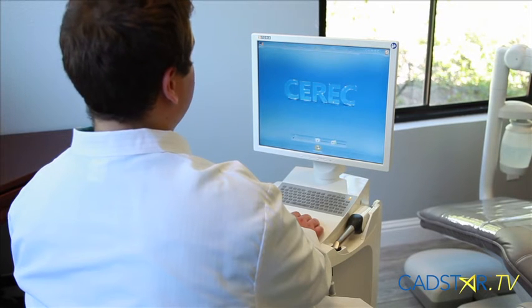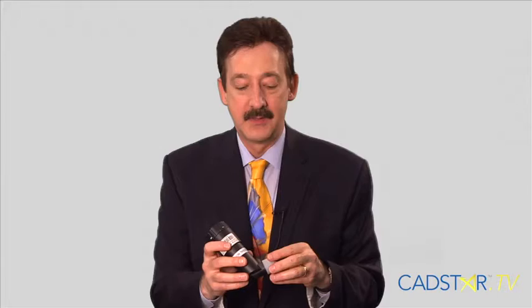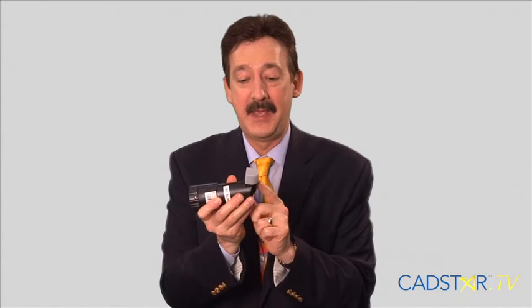Prior to starting your calibration process, there are a few things we need to remember — this is really easy, if I can get it, you can do it. Make sure that the rotational device on the end of your calibration set is rotated and screwed all the way in. That's really important before you start your software process. Also, take the end cover off your calibration set — the jig — that's where the camera is going to fit for the first process of calibration.